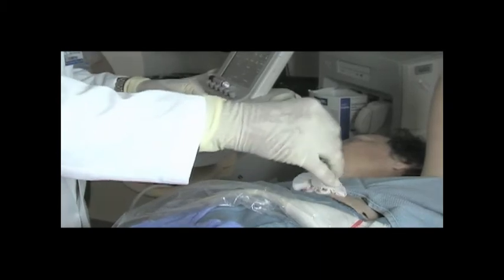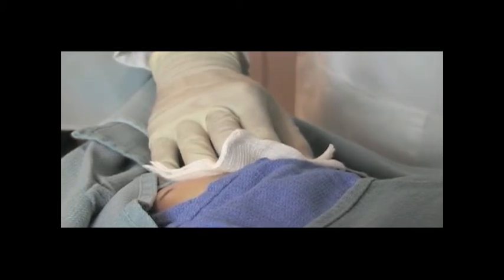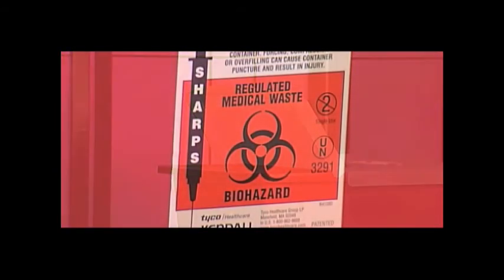For best visibility, hold the transducer over the biopsy target site and simultaneously deploy the marker. Remove the marker deployment device and introducer sheath from the breast at the same time, and immediately apply pressure to the biopsy site. This completes the biopsy procedure. Appropriately dispose of all used Solero products, such as the handpiece, introducer set, and marker deployment device.